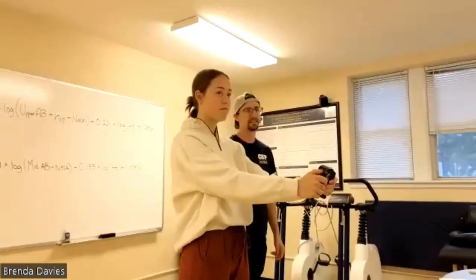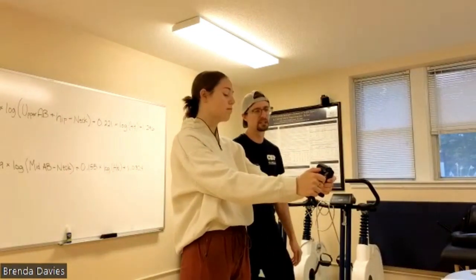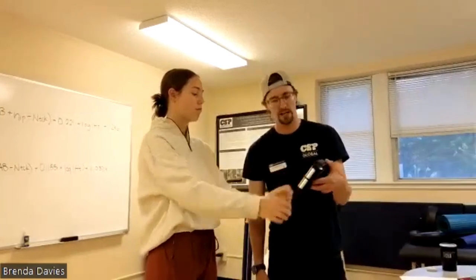Now, does it matter how far away she holds it? For the most part, as long as you just have it in front of you, that's going to be all right.